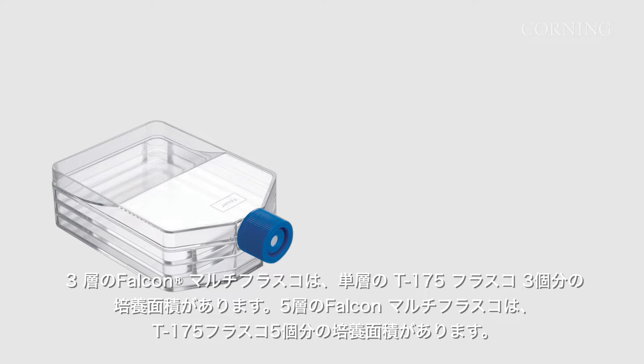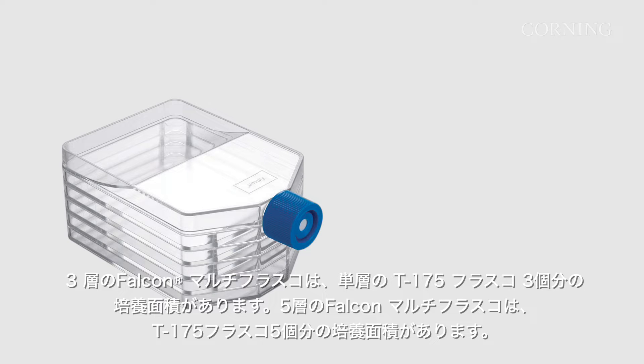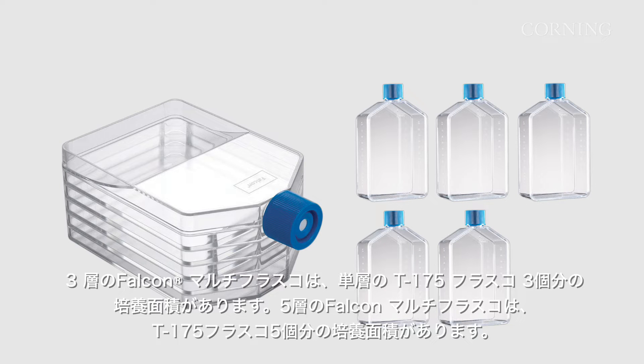A three-layer Falcon Multiflask has the same surface area as three single-layer T175 flasks. The five-layer Falcon Multiflask has the same surface area as five T175 flasks.